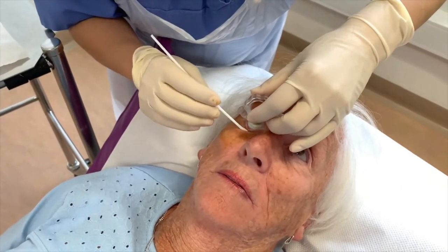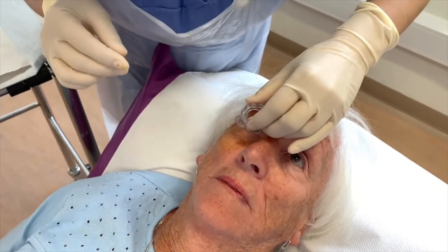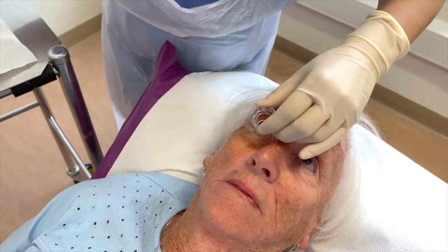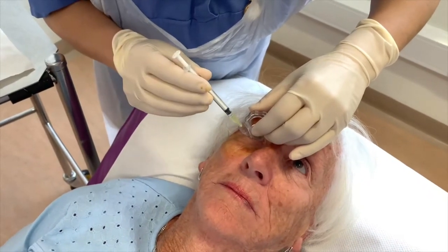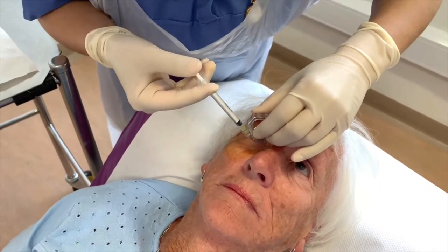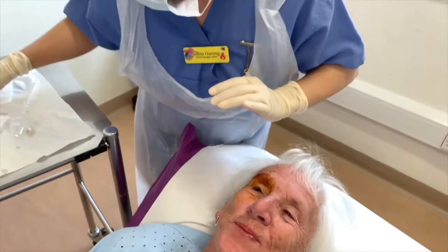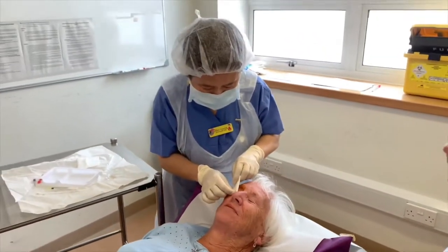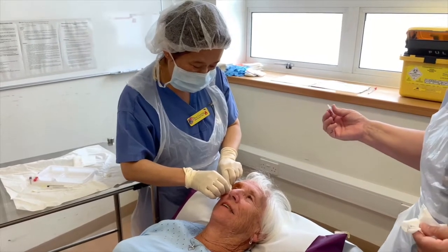Look down to your feet and look up. That's it. Keep looking at that point. Not to move your eye now. Stay very still there. Very still. And it's done. Well done. Close your eye. I think the smile at the end said it all, really, didn't it? Yeah, look up for me, please. That was very quick.